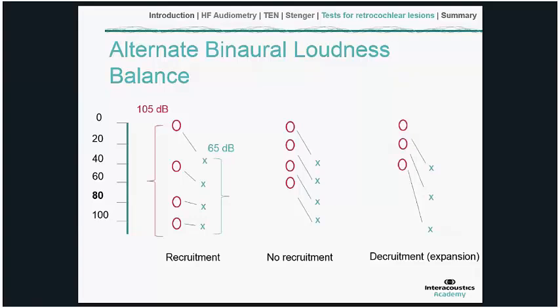In the right ear, the normal ear, we see the loudness changing from very quiet to very loud over the normal dynamic range for someone with normal hearing of about 100 or 105 dB. But the same loudness range in the poorer ear was compressed into a physical range of only 65 dB. And this is what's meant by recruitment, an abnormal growth in the loudness.